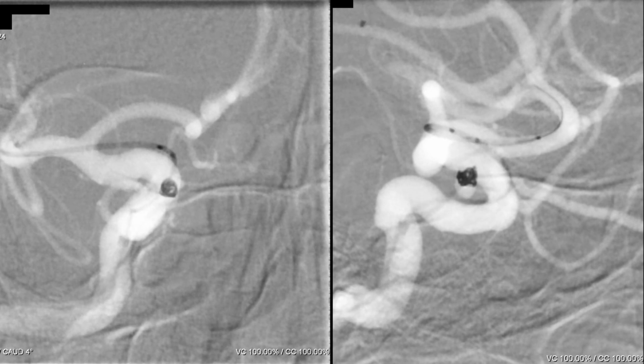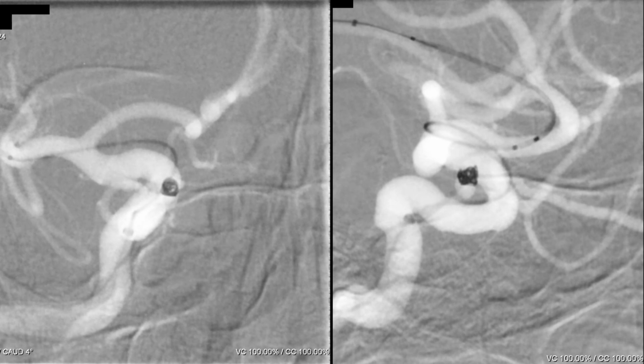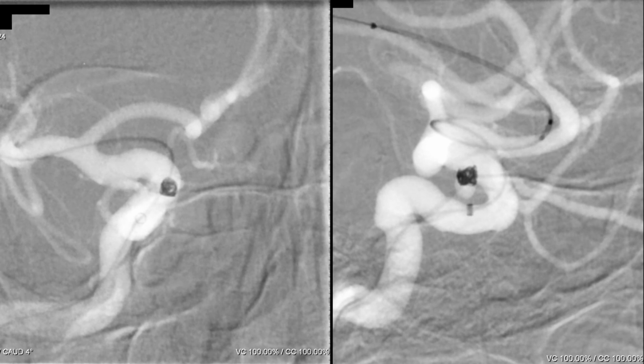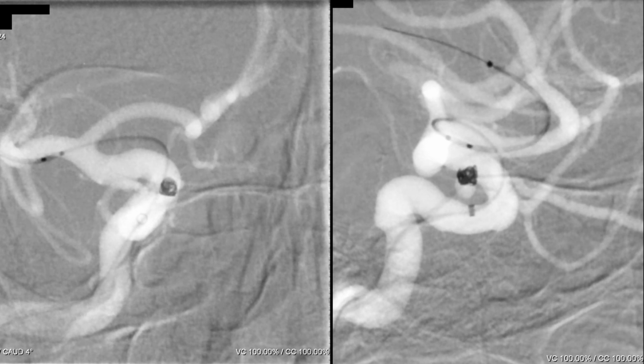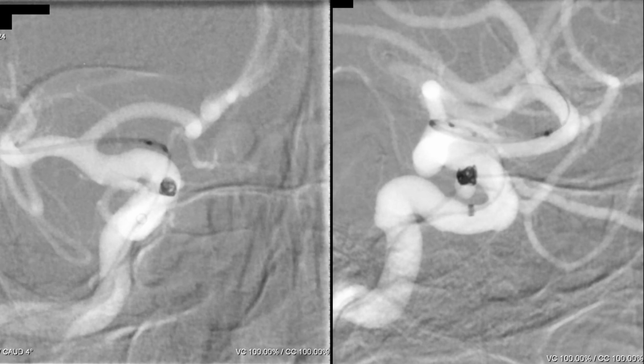And now we're pushing the flow diverter. And as you can see, there is an anatomy shift, and that's why we need soon a new 2D angiogram to compensate the anatomy shift and see the distal ICA bifurcation. And now we're pulling the flow diverter a little bit back, and now we will start to unsheath the flow diverter.